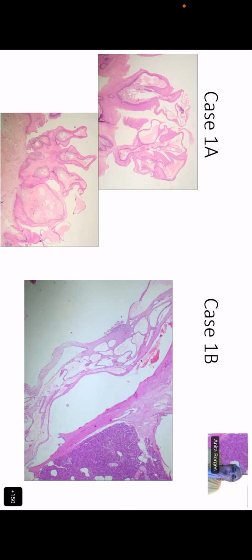When you say that something is papillary, you are making some kind of inference, an interpretation, and what you mean is that whatever is growing above the surface, number one, is epithelium, and number two, it is that epithelium which is the true lesion, that is actually forming the papilla, like a papillary carcinoma, or a papillary cystadenoma, or a papilloma of the skin, or the epidermis, or anything.